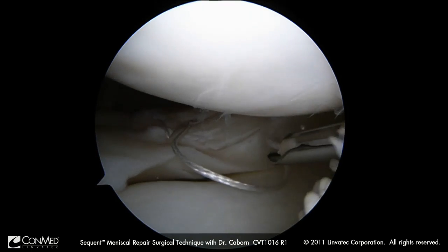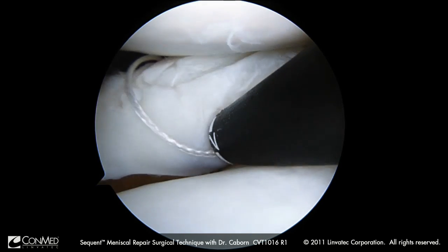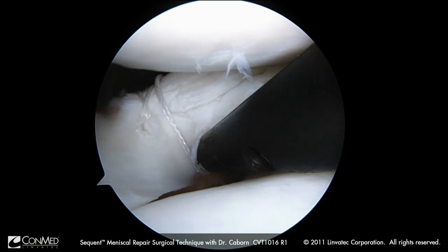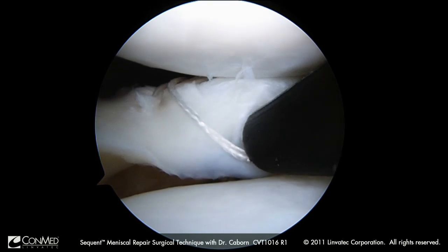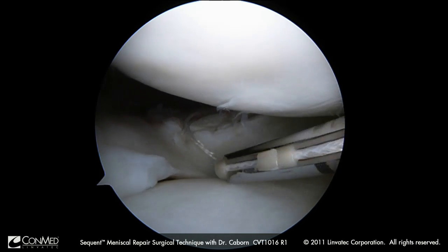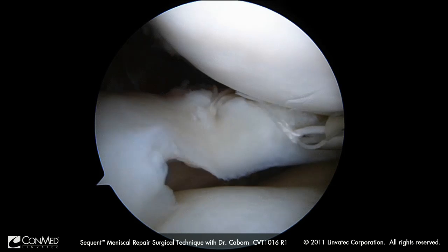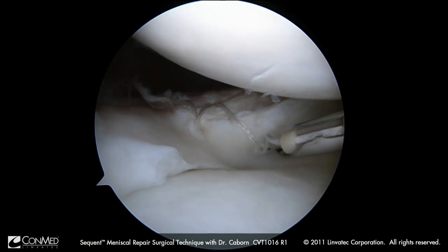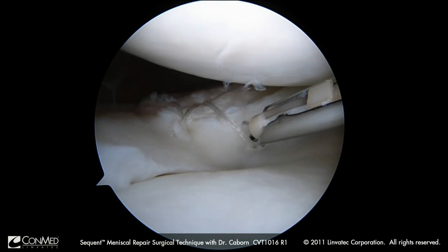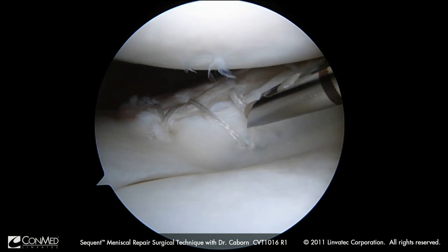Now I am wanting to go into freewheel mode, come back to give myself more slack. That bluntness of having my implant right at the apex of the needle is really protecting my penetration. I rotate my two revolutions, then fire my implant — you heard the click. Now I have got my suture across — you can see there is our vertical, our vertical oblique. Going into ratchet mode, we are going to tension. I have got four implants for three stitches. With a traditional all-inside approach I would have six implants — so you have less material inside the knee, less potential for failure, less potential for irritation.